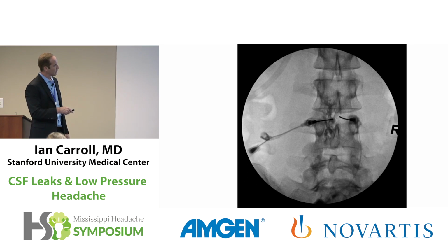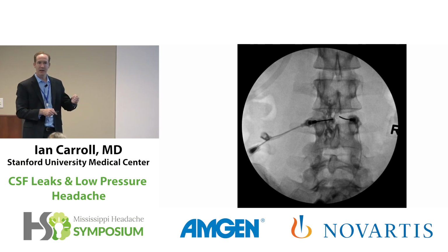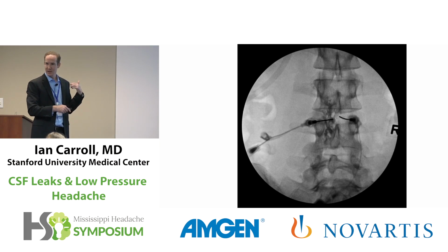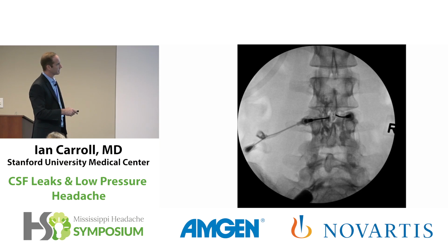And then when I give her contrast through the needle on the right-hand side, now you can see contrast covering the right-hand side too, again. Here's when you only have one needle in, no contrast spread at all to the other side. So imagine her blind lumbar patches that she had that didn't really work. What if they just happened to land on the wrong side of midline, right? All you got to do is drop a second needle.